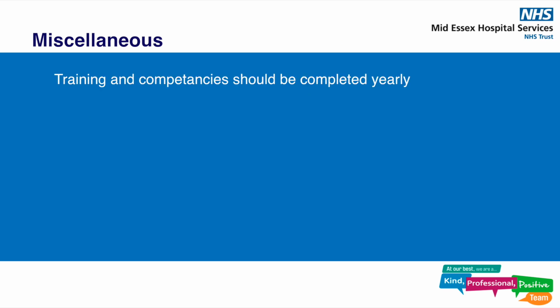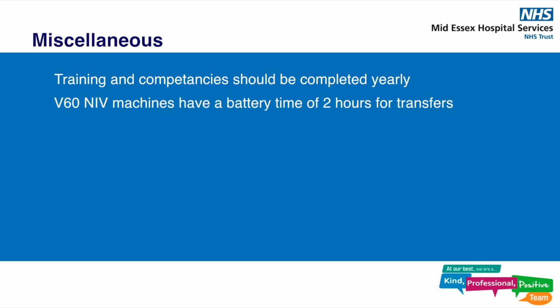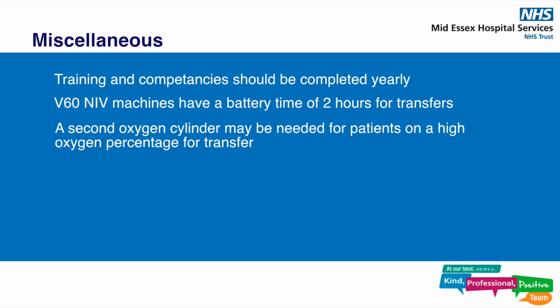NIV training should be completed yearly along with the competency. Please note that V60 machines have a 2-hour battery backup time for transfers, but should be plugged into the mains whenever possible. A second oxygen cylinder may be needed for patients on a high oxygen percentage for transfer.